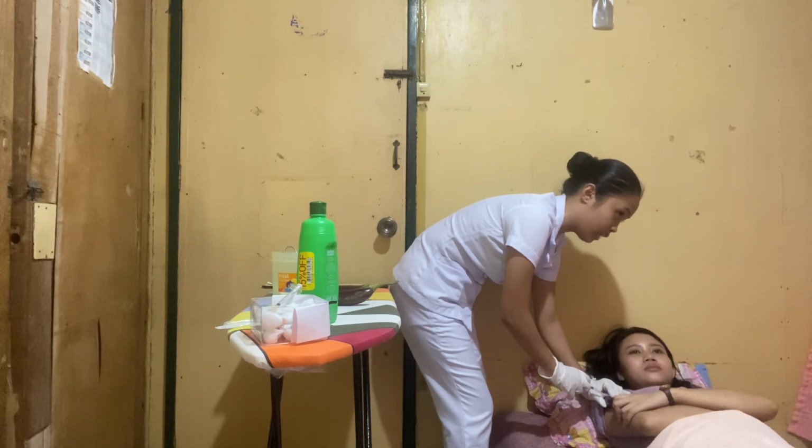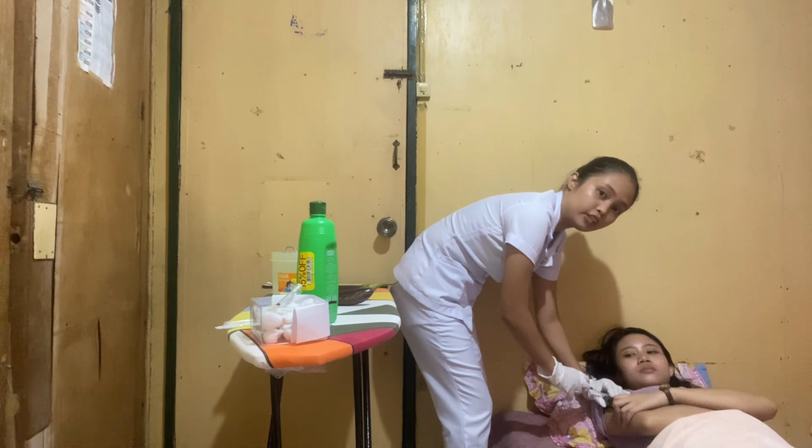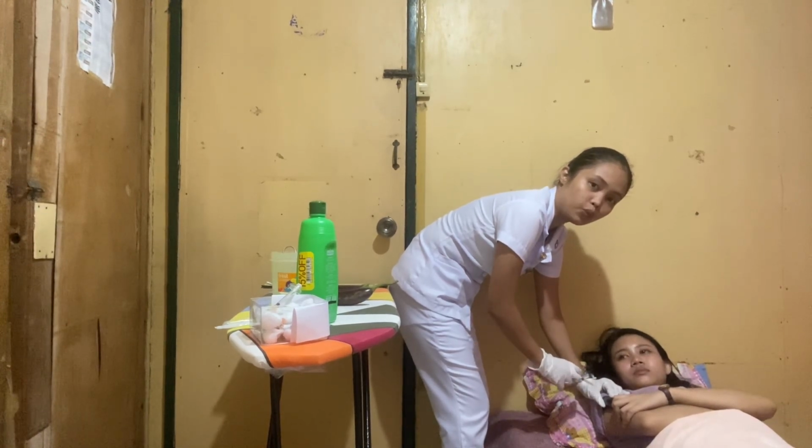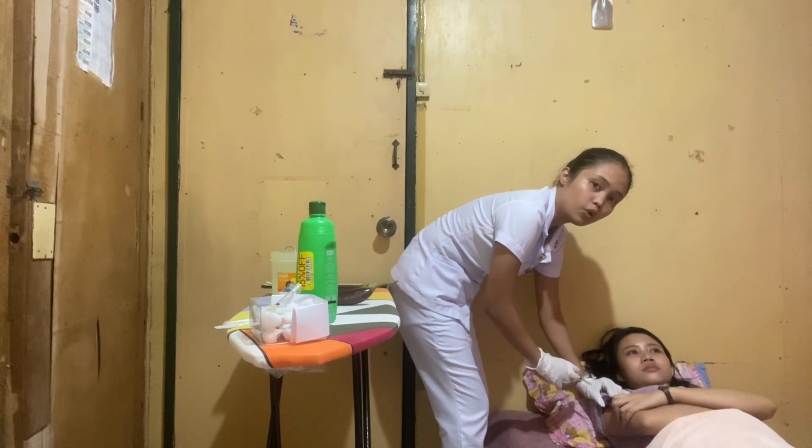And after doing that, we're going to aspirate, see if there is blood that will appear in the syringe. If there is, we're going to remove the needle and discard the syringe and get a new one. If there is no blood, then we can administer the medication steadily and slowly.